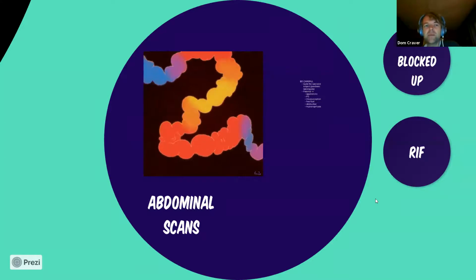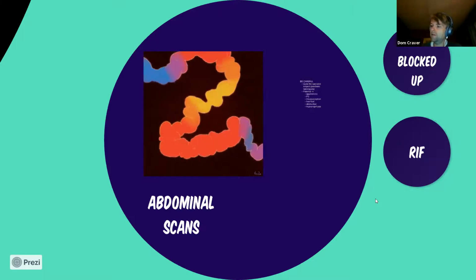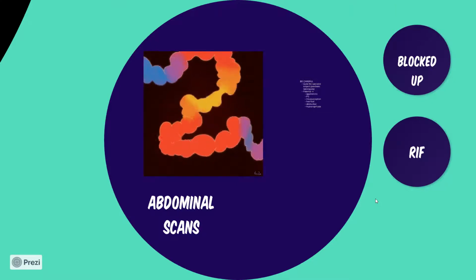Any questions about intussusception at all? Yeah, another fantastic case, John. So for the second case where the pediatric radiologist came in, if you'd been able to show them your images, do you think they would have been happy with that?